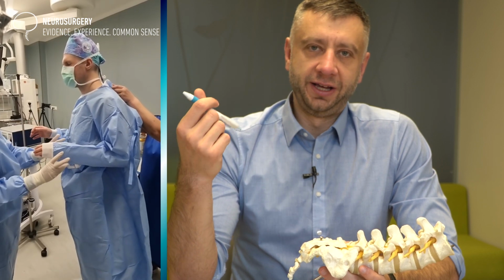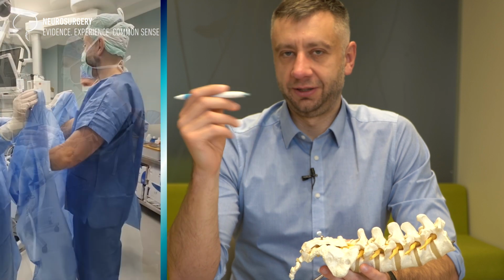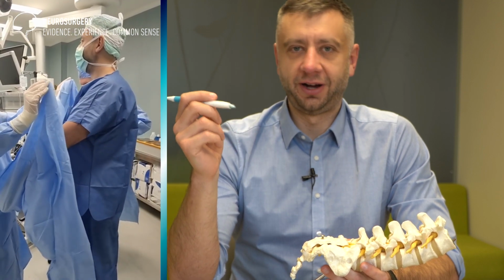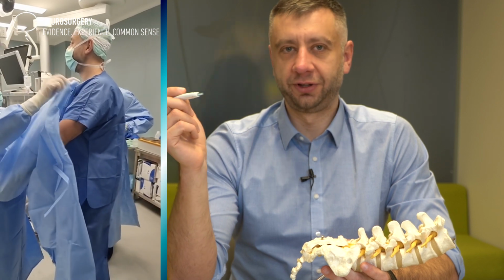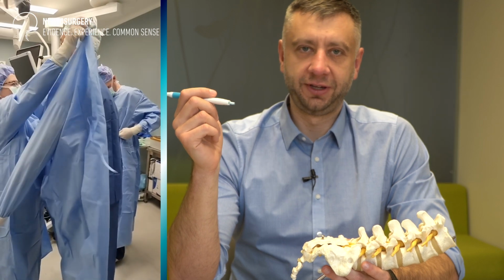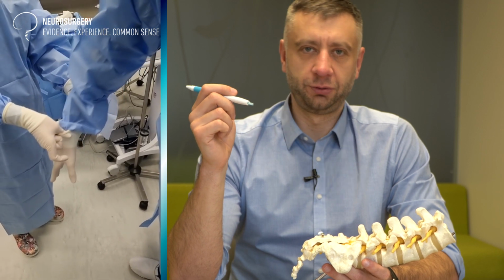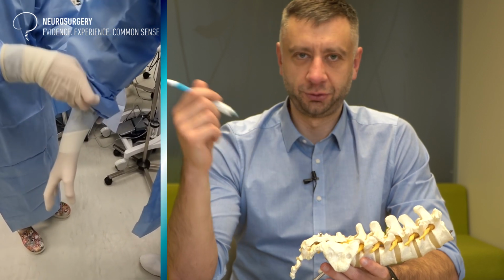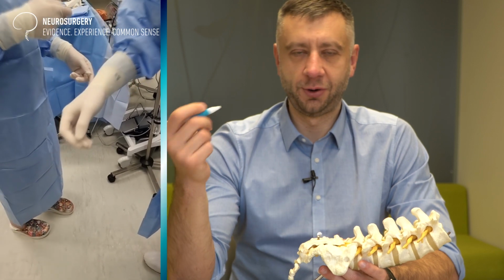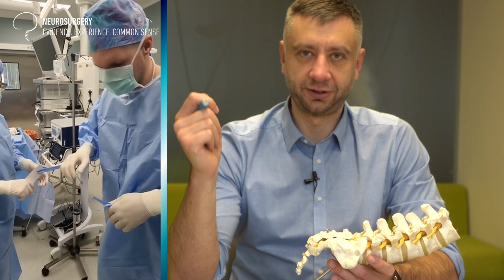Lumbar disc herniation is treated mostly by surgical intervention, typically lumbar microdiscectomy. Surely there are some variations to the surgical technique, and sometimes there are other techniques we can use, like laser ablation of the disc, which is useful in some cases. But I'm now discussing the most common, most typical scenario when lumbar microdiscectomy is necessary.